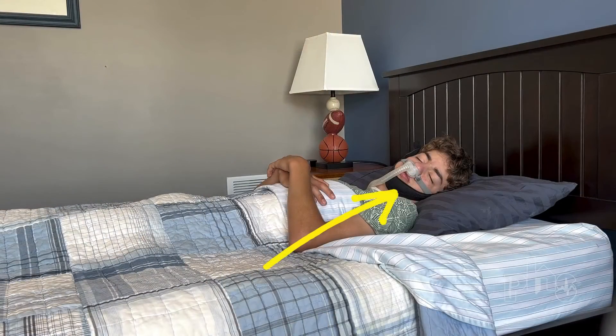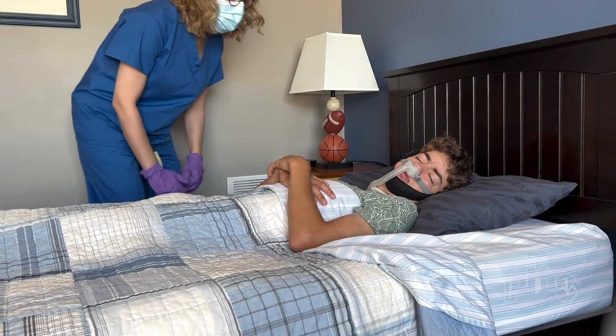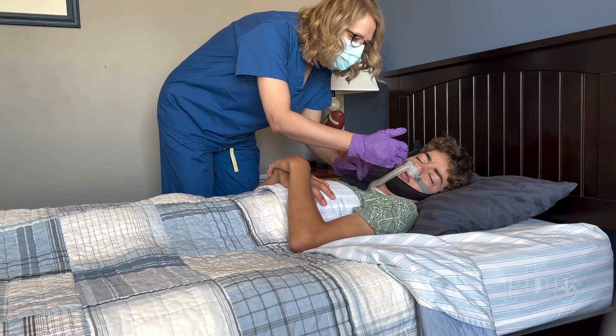Chin straps are available to keep the patient's mouth closed. Like full face masks, the patient must be able to remove a chin strap on their own or have a caregiver monitoring them during use in case of vomiting or equipment failure.